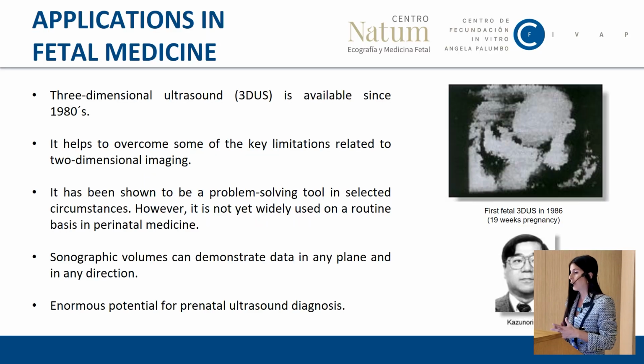Well, 3D ultrasound has been available since the 1980s. This is the first 3D image obtained in a pregnant patient, which was performed by this professor of biomedical engineering at the University of Tokyo. However, it was only after the development of the most recent computer technologies and ultrasound systems that 3D ultrasound reached the level of sensitivity and performance required to be seriously considered in clinical practice.